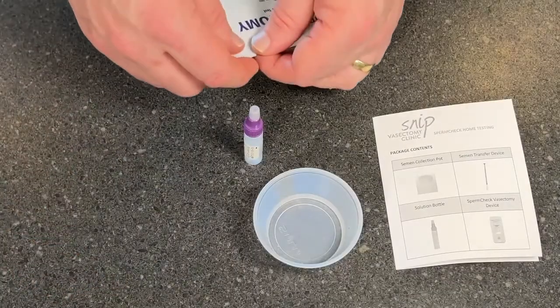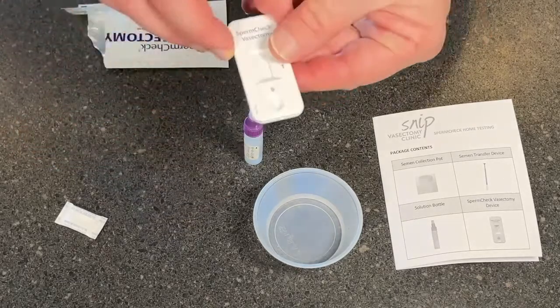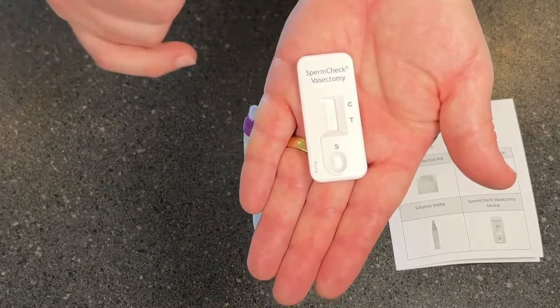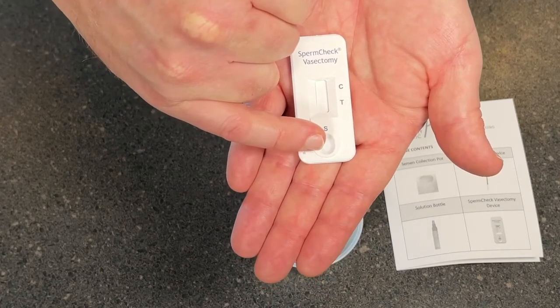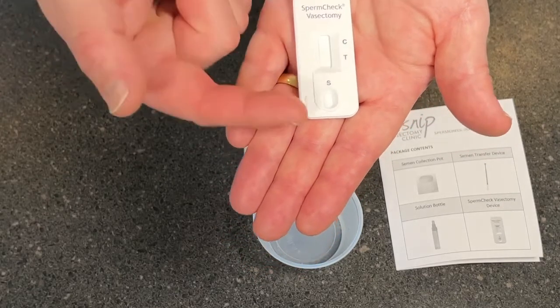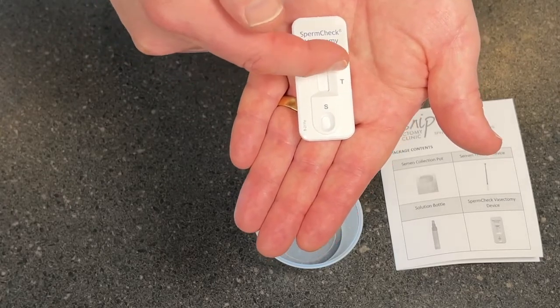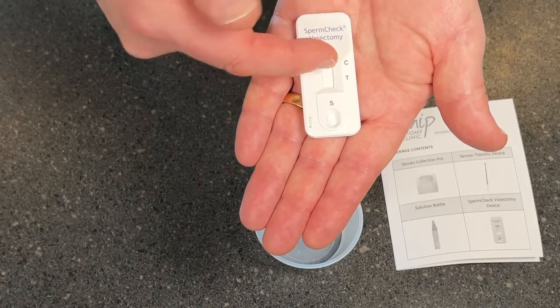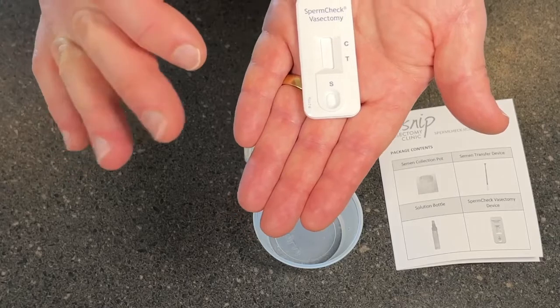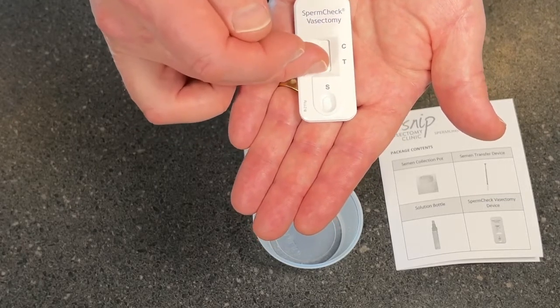We're then going to open up the vasectomy pack and pull out the test inside. If you look at the test itself, you can see there's a little well at the bottom marked S — that's where the sample is going to go. There's a window up here with a T and a C. C is for control and T is for the test. Once you've dropped the sample in, the fluid is going to move its way up into this window and produce one or two lines. It should definitely produce a line at C — without a line there, we don't know that it's worked. If we see a line at the T mark, no matter how faint it is, that suggests you are still fertile. No line at T — just a single line at C and an empty space — means the vasectomy has worked.